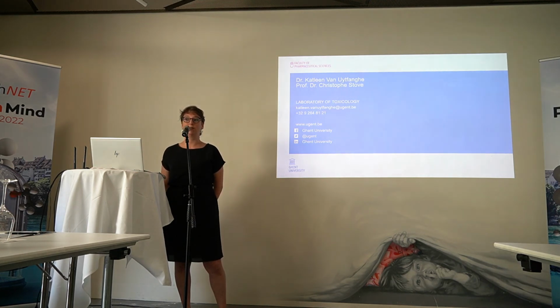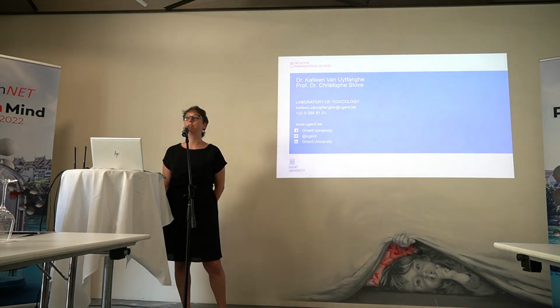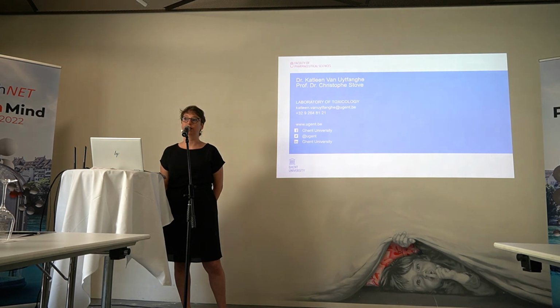We don't use it ourselves. For QC purposes, we actually just use the materials from the EQA scheme, but it's true that there are limited sources of matrix-based reference materials, and I have no clear overview of what exists and what doesn't exist. Maybe Julia, do you know it?